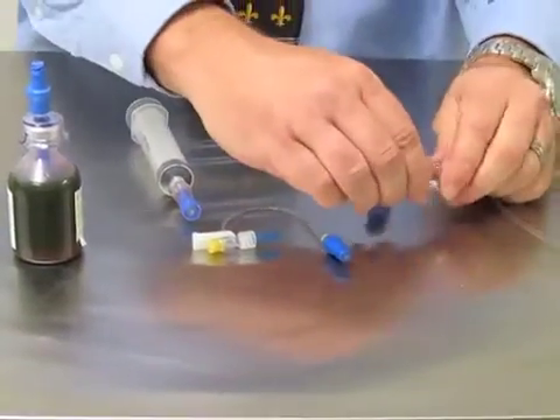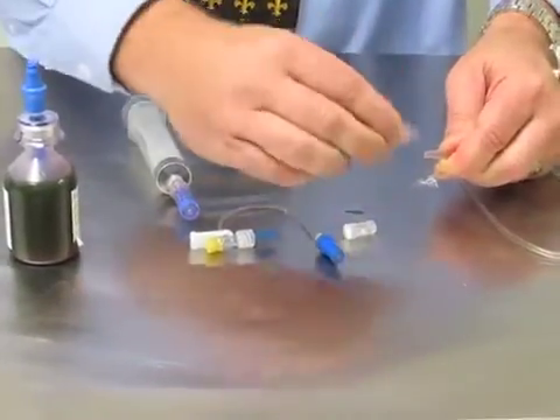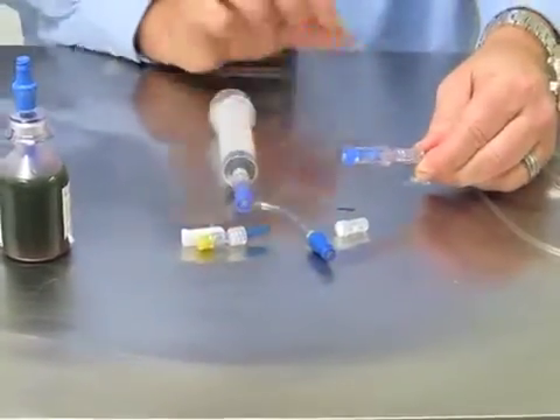Once the line is primed, I'm going to take the cap off and add the Spiros and lure lock it on so that there are no accidental disconnects.